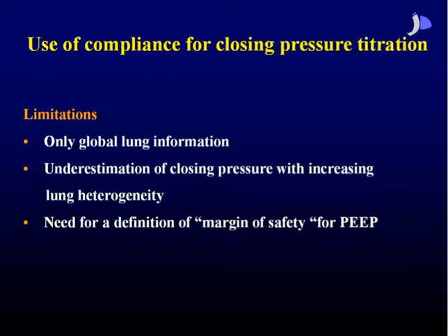So it's to go earlier in the evolution of these patients. But answering the specific question of what's better, a little bit of collapse or a little bit of overdistension, because we're always moving in that range in these sick patients, I don't know. My guess is that I would rather ventilate a patient with a little bit of overdistension than collapse, because collapse can be an ongoing process. And if you don't have the adequate level of PEEP, and you still have some collapsed lung areas, any little change that can cause some lung instability will cause your lung to collapse quickly.